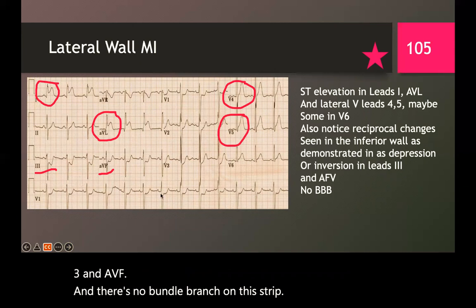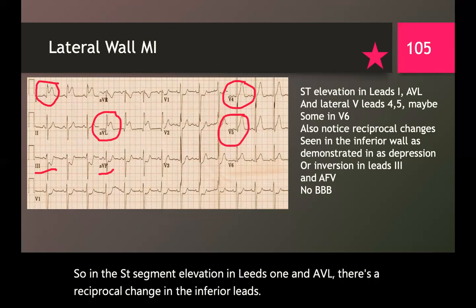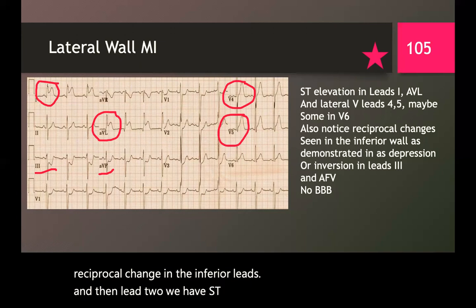So with the ST segment elevation in leads 1 and AVL, there's a reciprocal change in the inferior leads. In lead 2, we have ST depression, and in lead 3 and AVF, flipped T waves.